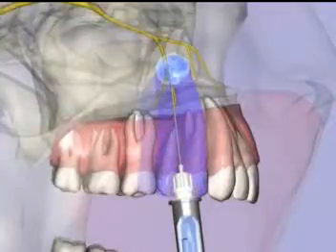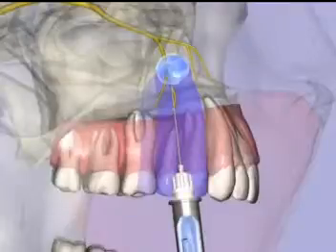The Middle Superior Alveolar Nerve Block provides pulpal anesthesia to the maxillary premolars and the mesial buccal root of the first molar, along with the supporting buccal soft tissues and bone.